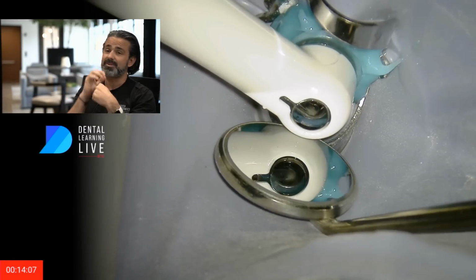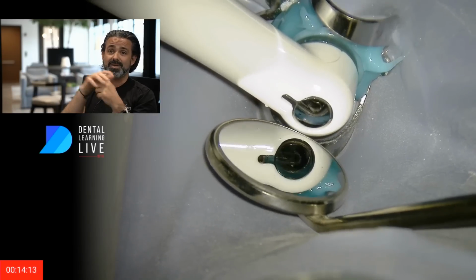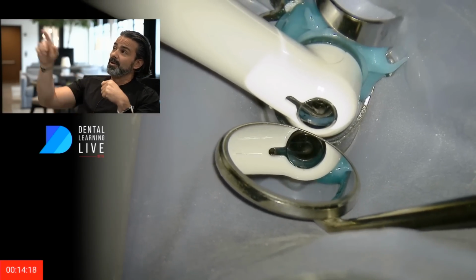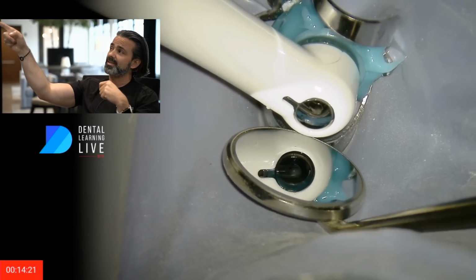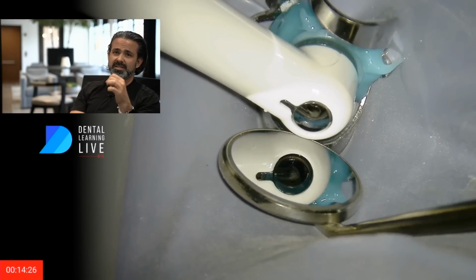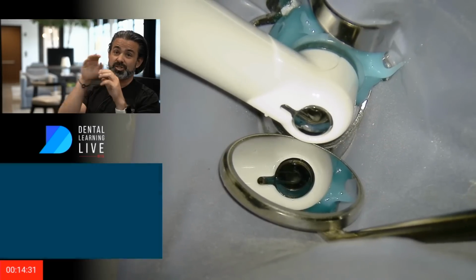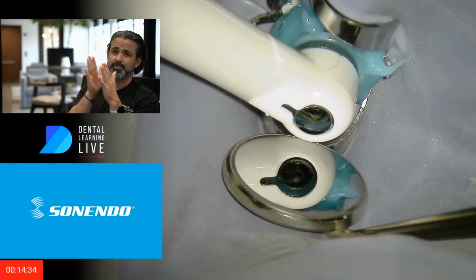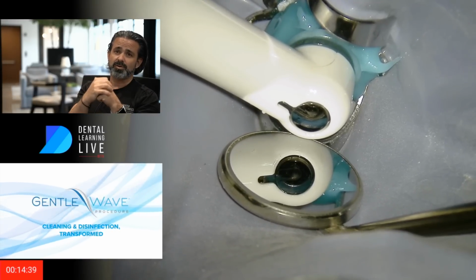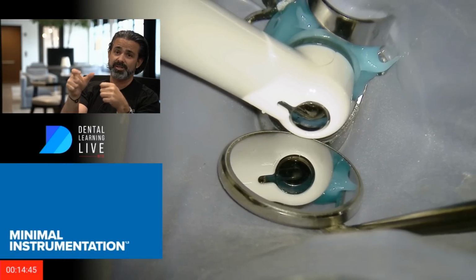So I stopped and went to the fluid dynamics and see, hey, if I use these fluid dynamics, is that going to help me get to the end of this thing? Because I haven't even determined my length yet. The other thing is with this APM, I always call that the dancing bubble. It's just a little white cloud. And that's actually the fluid dynamics, that's where the shear force of the fluid dynamics is taking place. And the principles, as you can see in the explainer video, although that's for the molar, it's the same physics. Nothing's really different, it's just engineered differently in the procedural instrument.